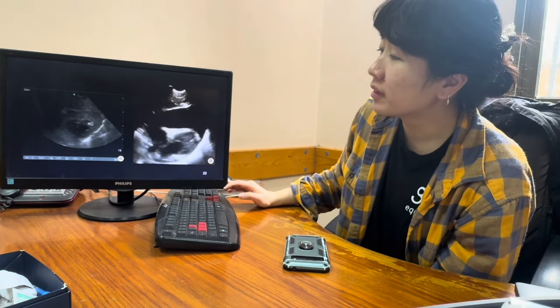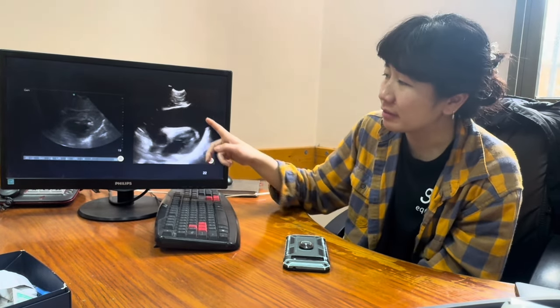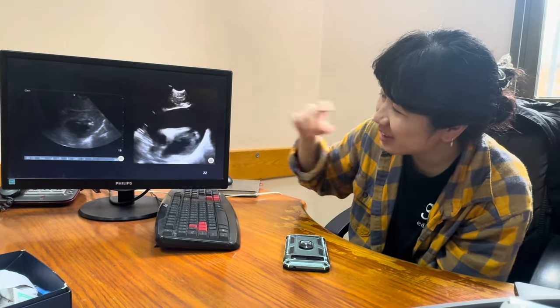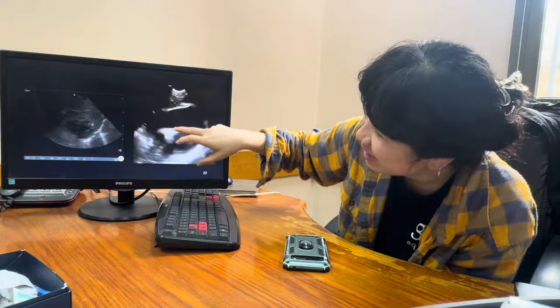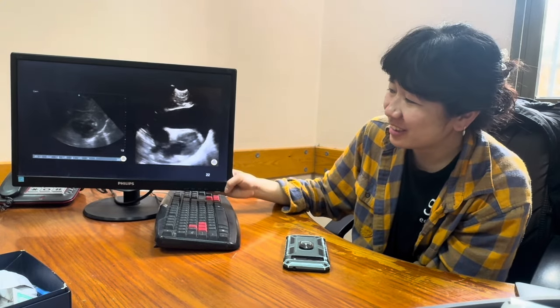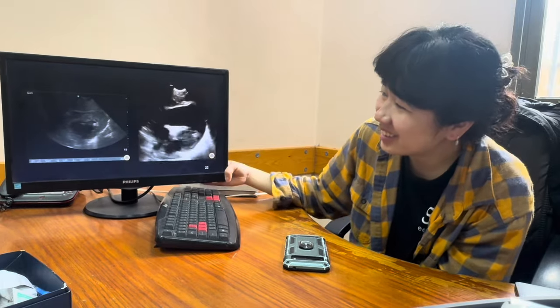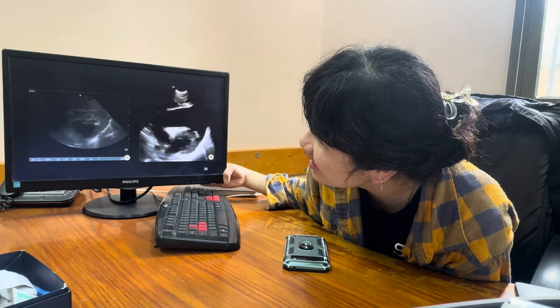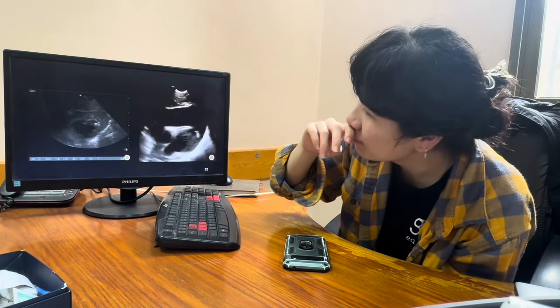So here again, what do we think? What about this one? Swimming. It's the swimming heart sign, which means this is related to massive pericardial effusion.